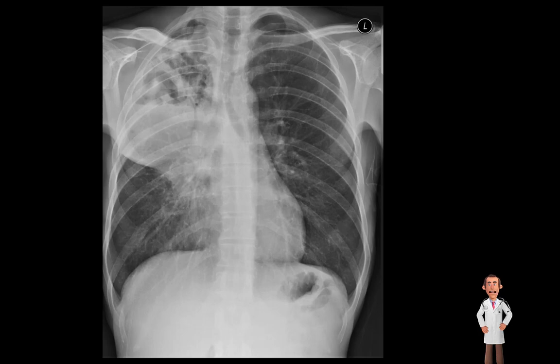In terms of other abnormalities on this chest film, if we look in the right upper zone we can see a healed right clavicle fracture. This emphasises the importance of looking at the entirety of the film and not ignoring any areas in particular.